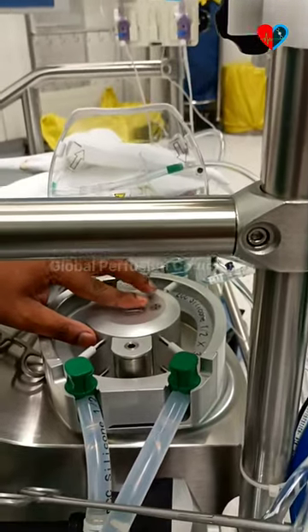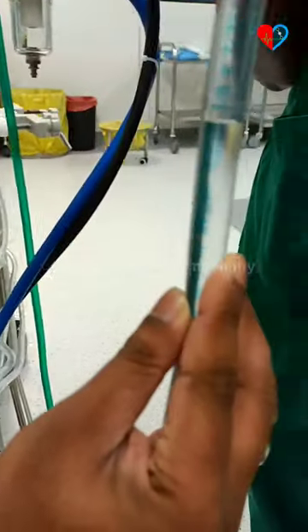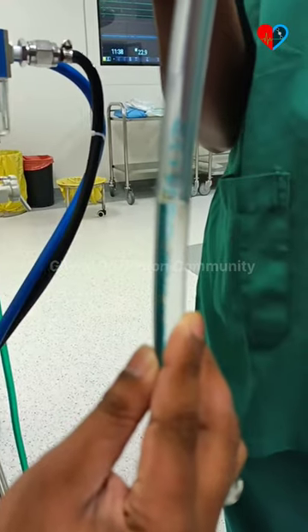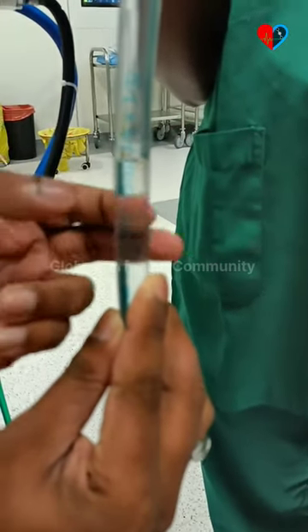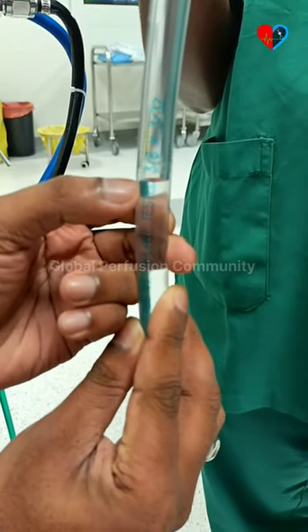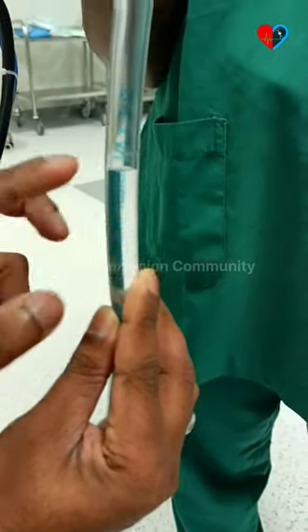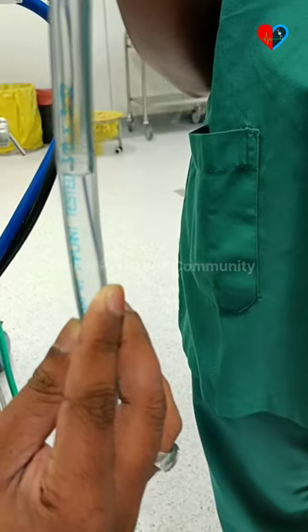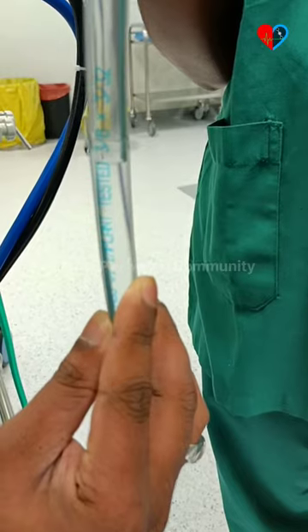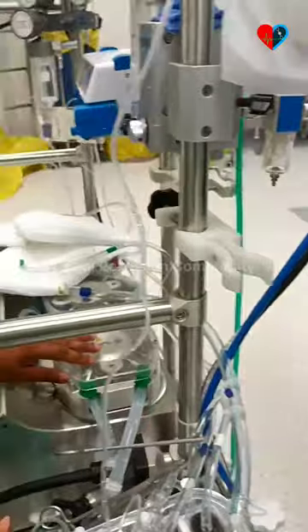We are reducing the occlusion by one point. Now you can see the fall of fluid here slightly from this mark. This is how we do occlusion in the meniscus fall method, also called the fluid drop method. We have now checked for one roller.